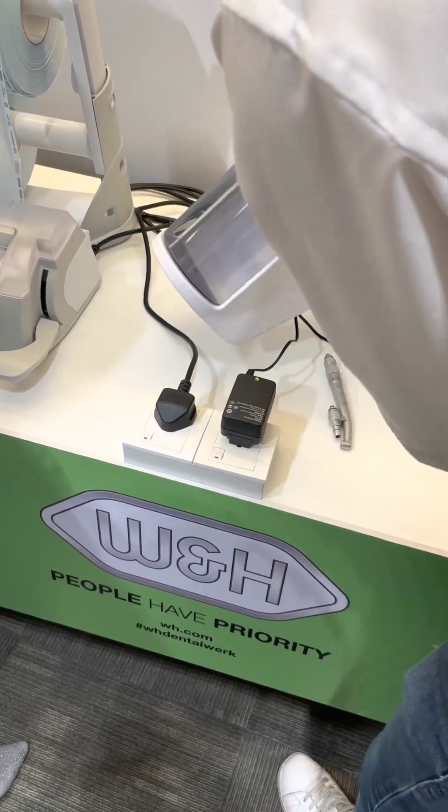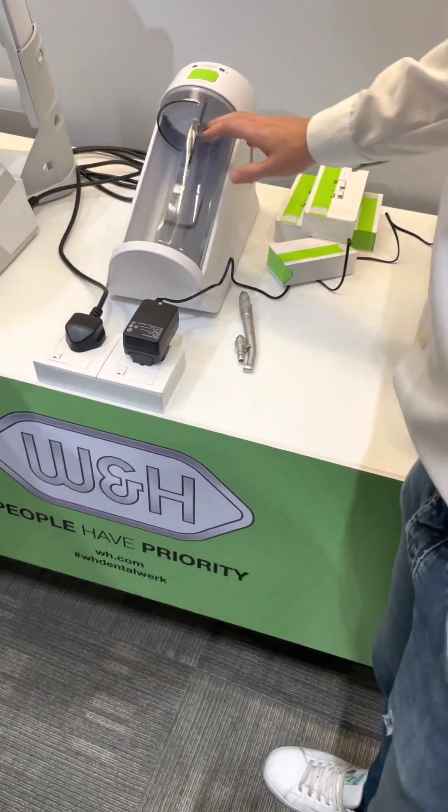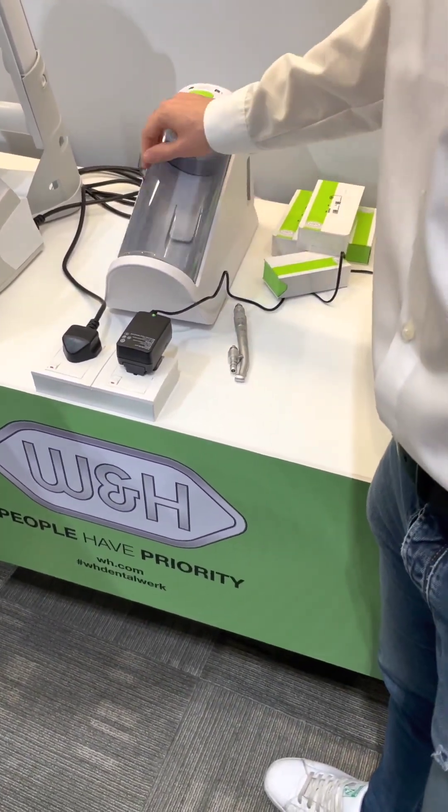No electrical supply, nothing. The door is a sliding door.